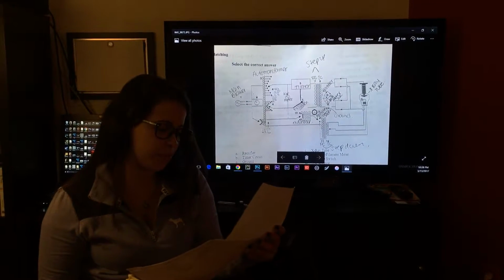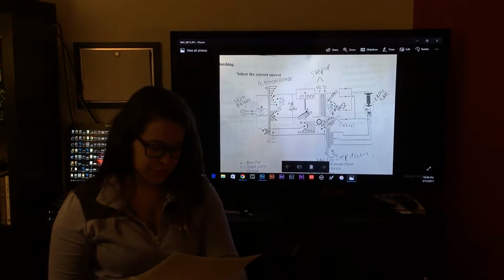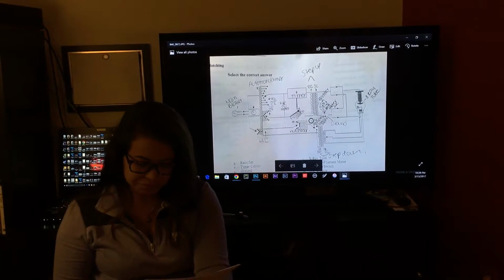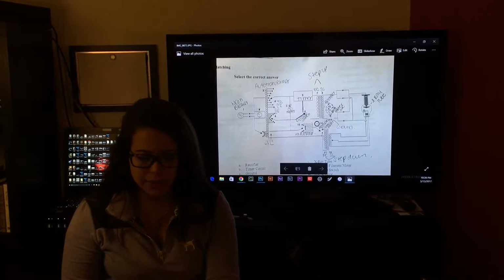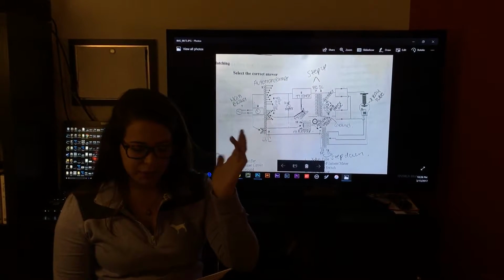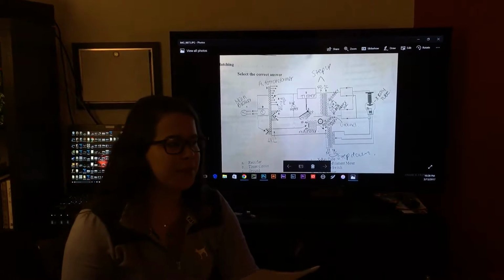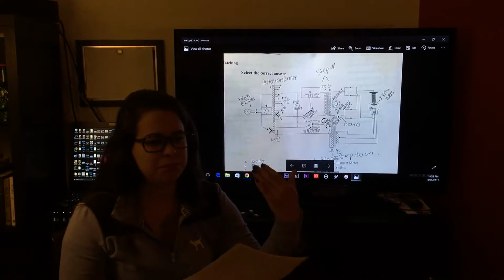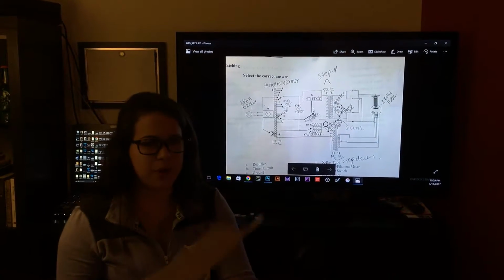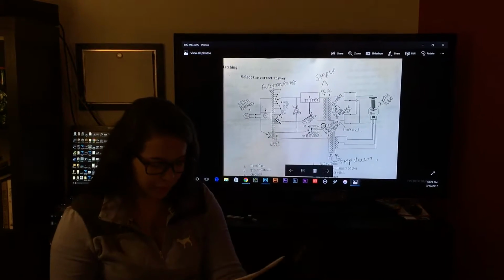We're also going to go over the minimum response time. The term minimum response time refers to the shortest exposure time that the system can produce. Usually the technologist increases the mA so that the exposure time is shorter, especially for those patients like kids or patients that are having a hard time holding their breath.